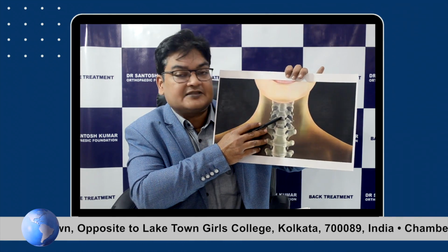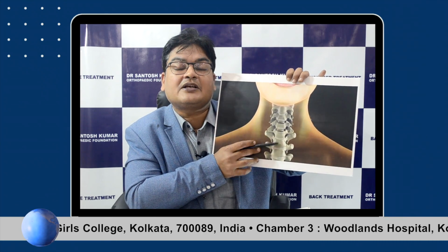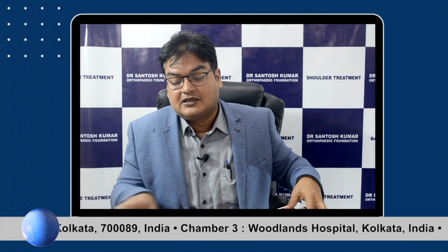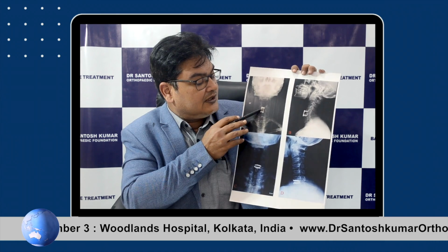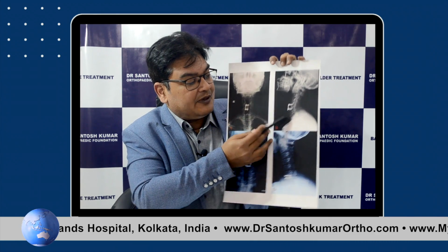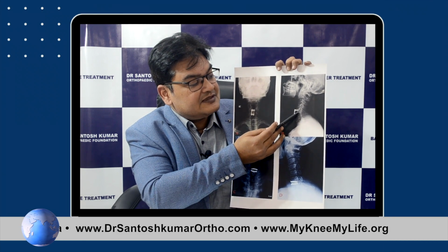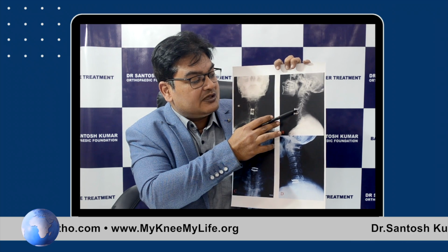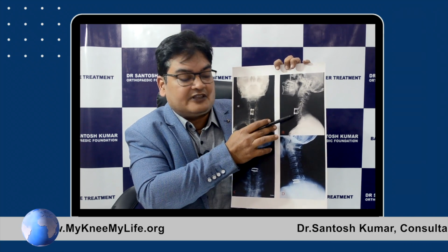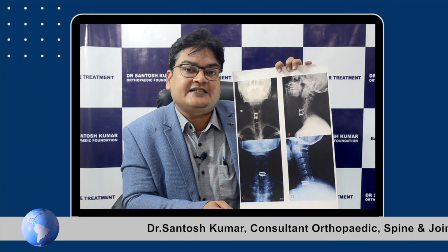In this photo we can see the diseased disc material has been replaced by a prosthetic, artificial disc, which is known as cervical disc replacement or a disc arthroplasty. In the X-ray we have compared that in the upper X-rays fusion has taken place, in which the diseased disc, which is the jelly between the 2 vertebral bones, has been removed, a cage has been put and a plate has been fixed. So this is known as anterior cervical discectomy and fusion or ACDF.